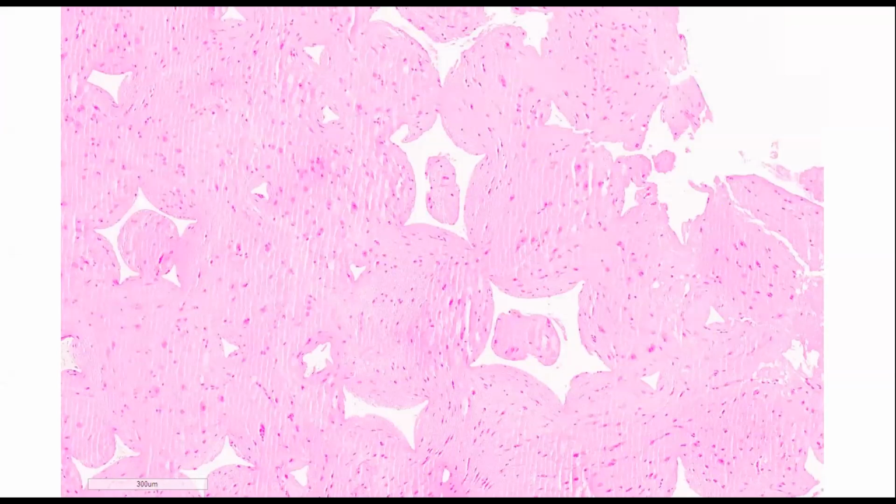Guess what? You never see this artifact at MD Anderson. Why do you never see this artifact at MD Anderson Cancer Center? Because we do not put brain tissue and brain tumors between 2 blue sponges. This is blue sponge artifact. Brain tissue, all it has for support is glia. There's no collagen. You don't have the bundles, you don't have fibroblasts, bundles of collagen.